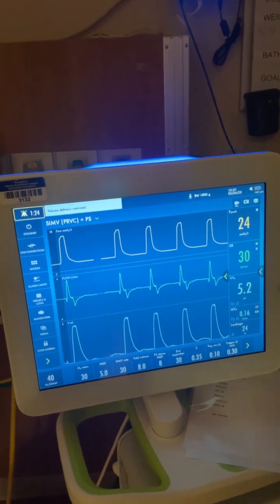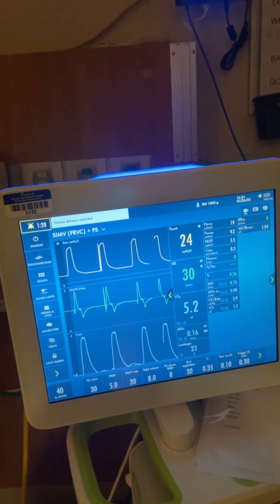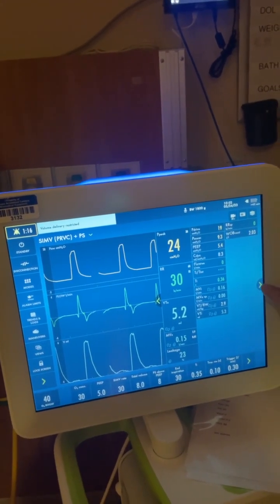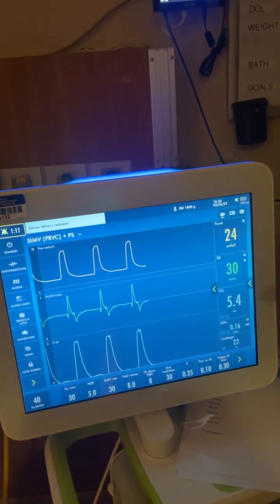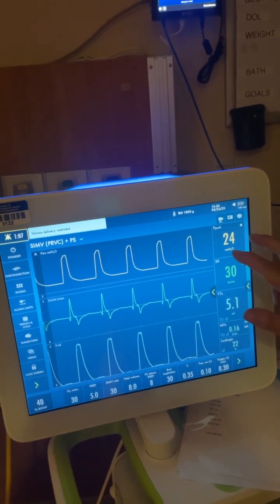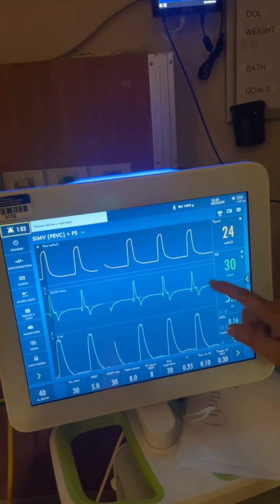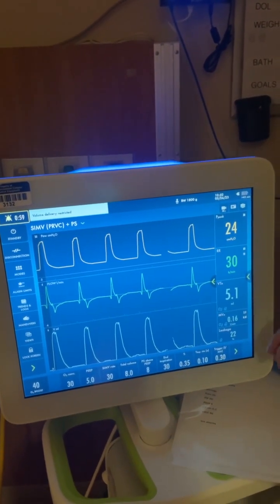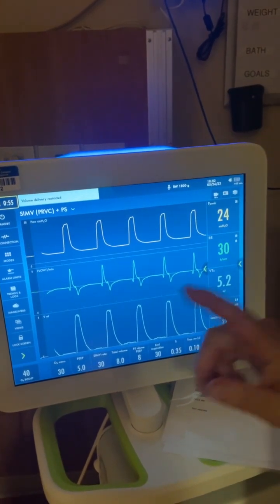Another thing is if you want to look in here and see what's going on with your patient, there are more numbers in here. A lot of these are things you as a nurse are not going to necessarily need to know, but it's just in case you want to. It's all there. And if you want to keep it simple, we'll just keep it down to here. Okay, these are your pressures, your pressure waveforms. Green is for your rate and your flow. And then your minute volume and your actual tidal volume right here. Okay, so silence, we covered O2 boost.